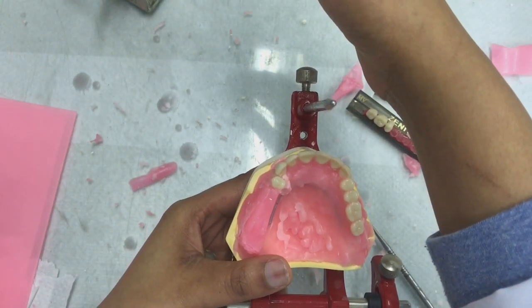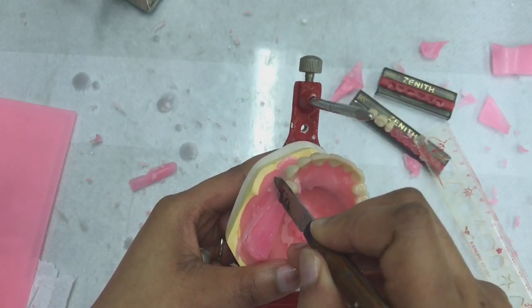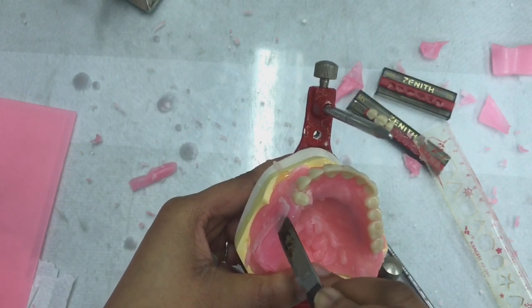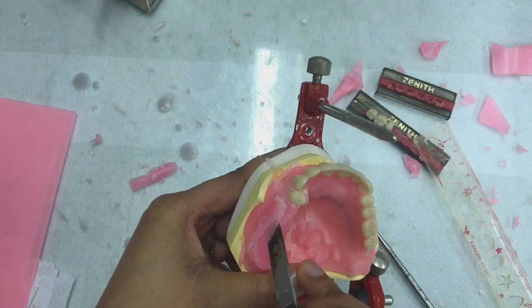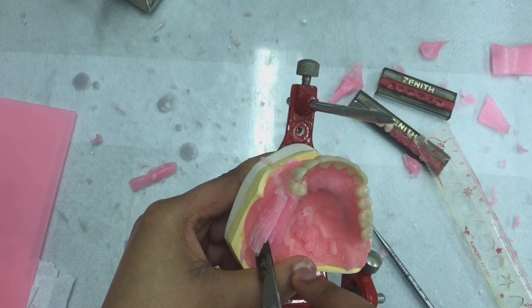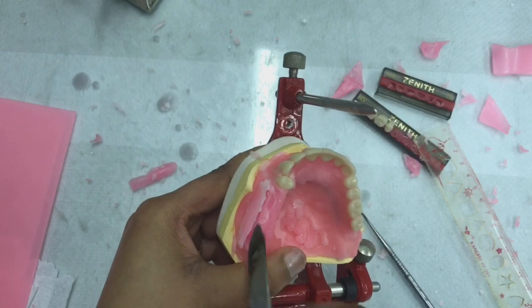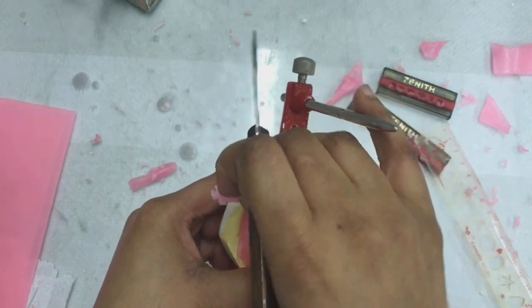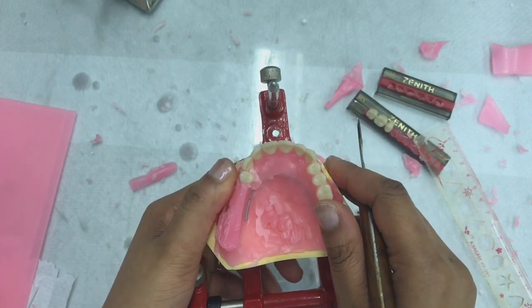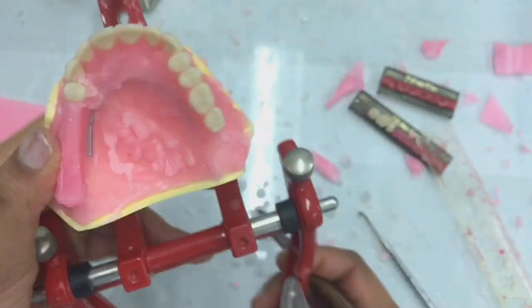It's very important that when you are setting up, you identify wax that will obstruct your view, because if you set up your teeth blind, you're going to be setting yourself up for failure. So if you find that there's wax that is a bit bulky, you just need to remove it. Okay, so that's about fine. Okay. So now I can clearly see my premolar.